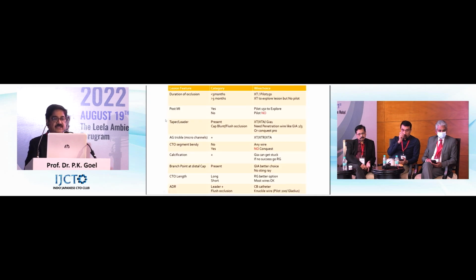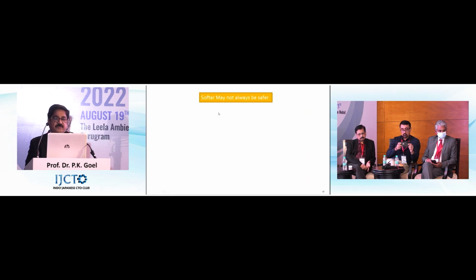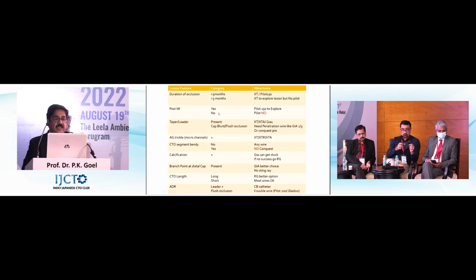This is the same thing that I just talked about: less than 3 months, more than 3 months. Post-MI Pilot is a good option. And tapered tip, the CTO segment is non-bendy, but if it is bendy, then no Conquest. Calcification, Gaia can get stuck, so that's that.